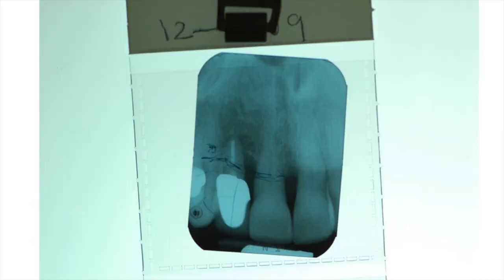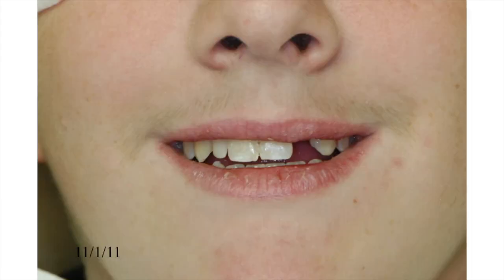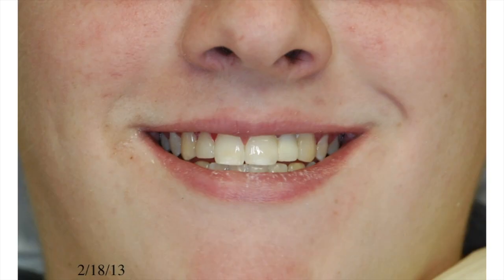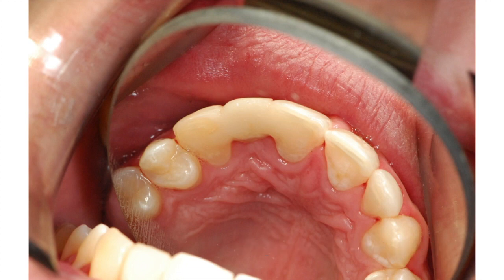Here is another example of a periodontal-involved lateral that I extracted and bonded a tooth in place. This bridge has also been in the mouth for over 10 years and it looks just like it was placed yesterday. This is probably my favorite case — a 14-year-old who presented in 2011 with a peg lateral and missing lateral incisor. Here he is in 2013 for a follow-up exam and it looks really good. Now he's 20 years old, six years later, and it looks great. I can't find a reason to replace this resin-bonded bridge with an implant.